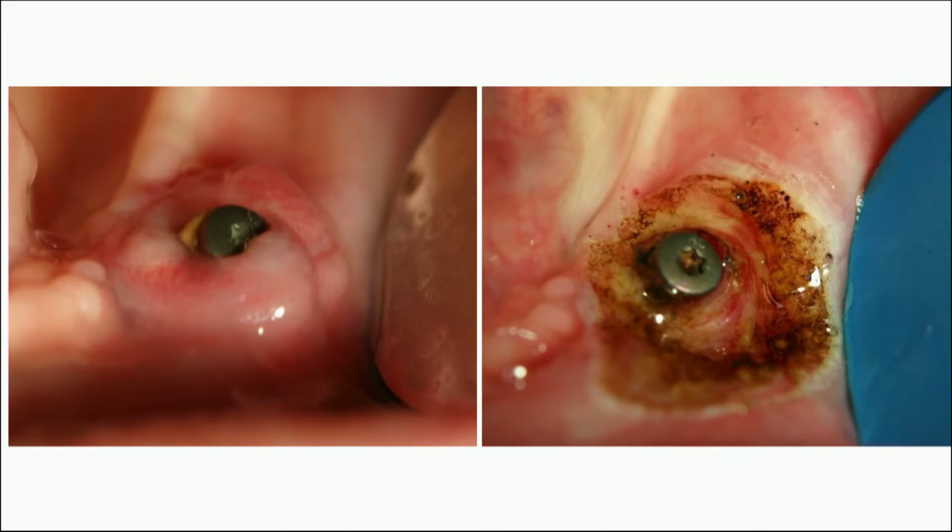However, the interesting thing is that when we treat that with a laser, by altering the tissue temperature, we can actually also alter the keratin pattern. And this is sometimes called neokeratinization.